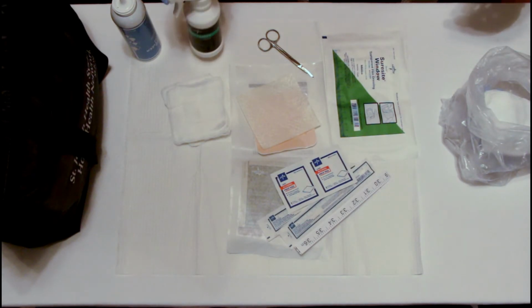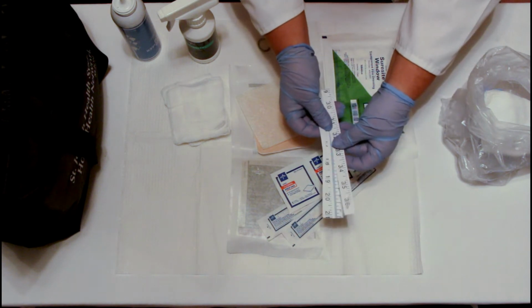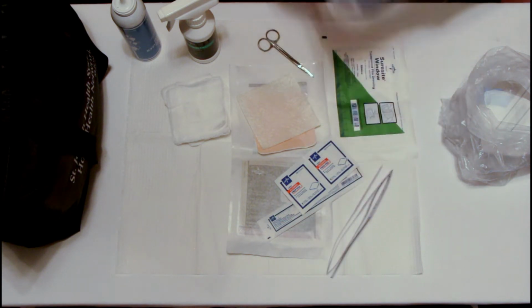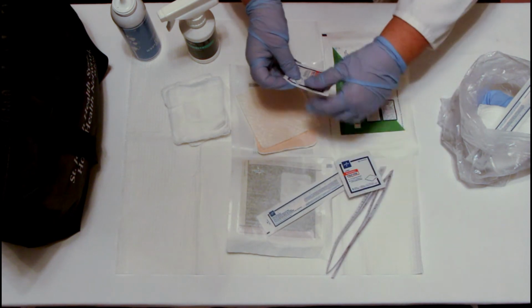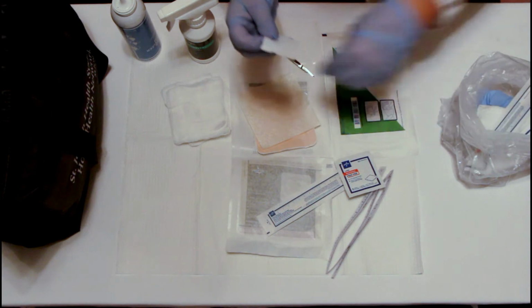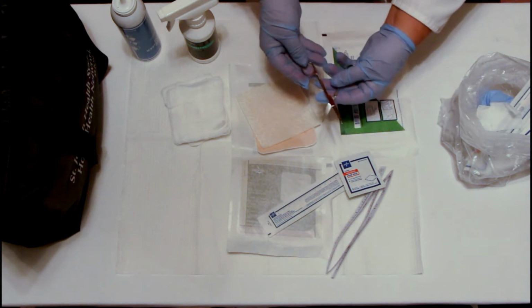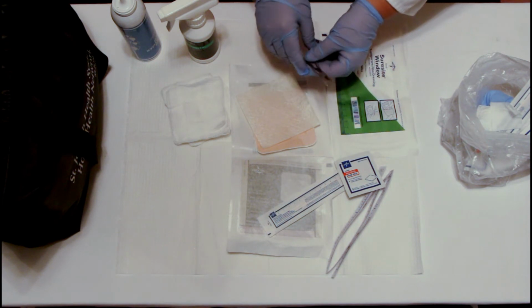After the clinician has cleaned the wound, now is a good time to collect wound measurements. Use the cotton-tipped applicator package with the measurement or the paper measuring tape. Before using the scissors, the clinician must clean them with alcohol. She also allows time for the alcohol to dry.